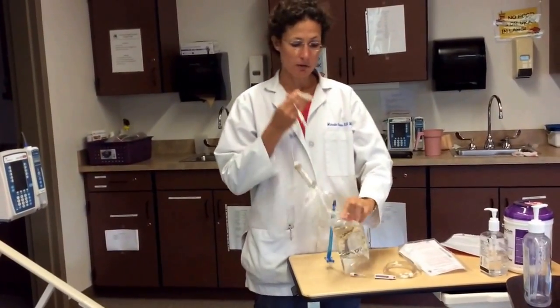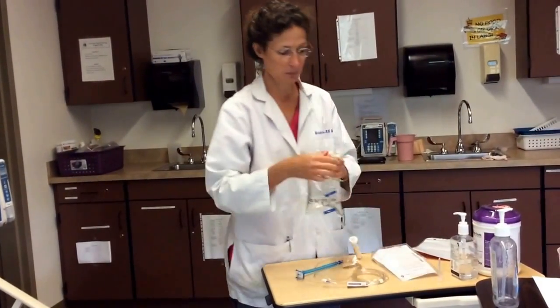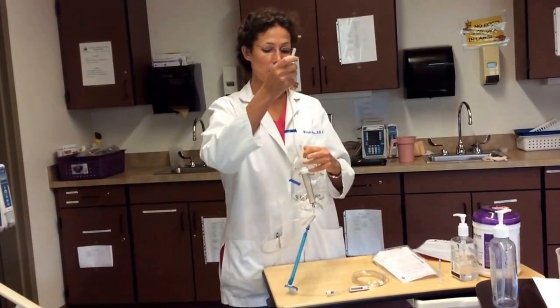Now we're going to spike our 500 ml of saline. And it doesn't matter which one of these we use, okay?